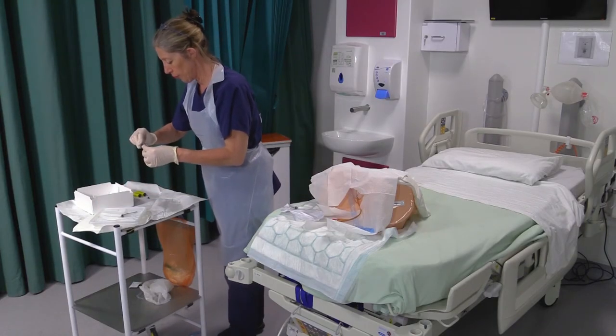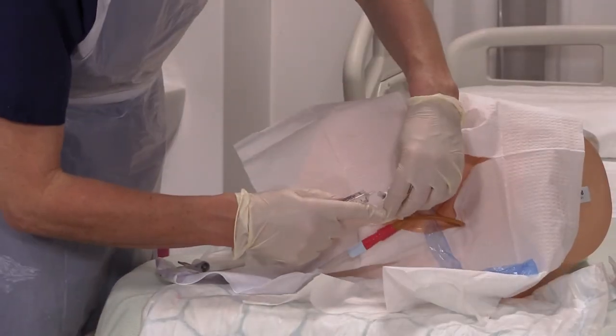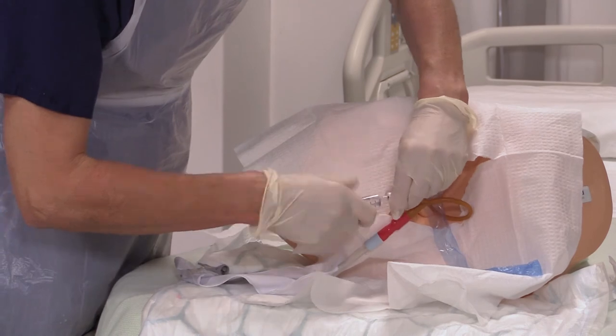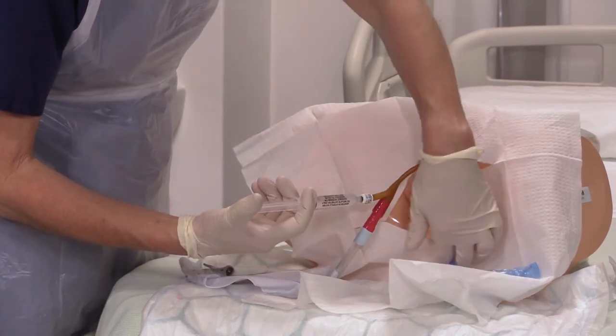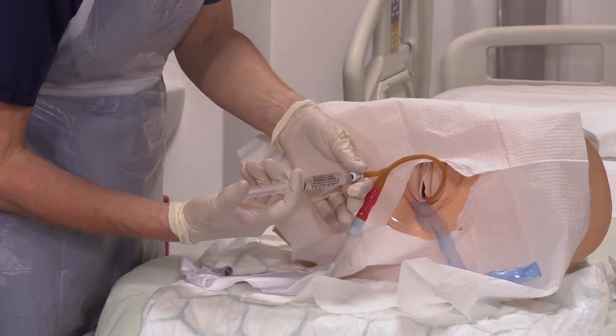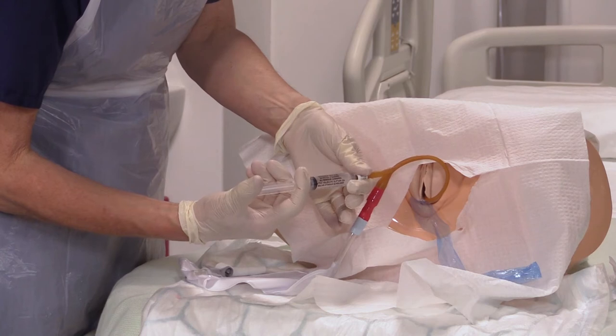Having confirmed by observation, slowly inflate the balloon with 10 mils of sterile water, following the manufacturer's instructions. The patient should not feel any pain during inflation of the balloon. If she does, the balloon may be in the urethra. Stop and deflate.